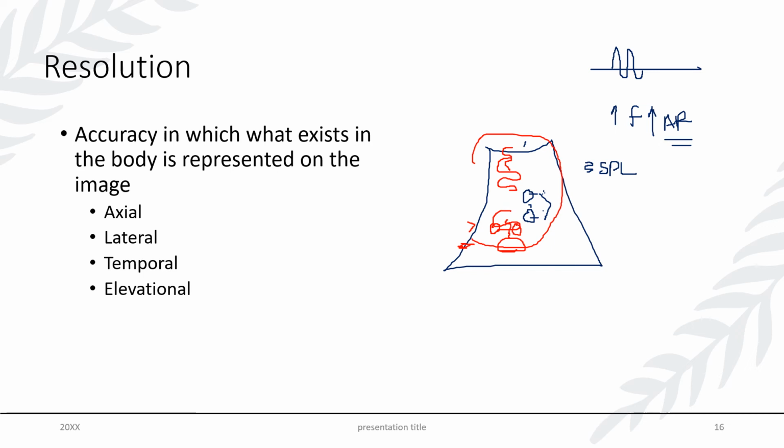A phenomenon of ultrasound pulses is that as they travel, they become more and more broad after a certain narrowing point. That narrowing point is what we call our focal area. We are allowed some adjustment of the focal area, which we'll cover more in transducers next week, but we do have to control our focus to keep our beam narrower, and those narrower beams are able to slide in between two different objects, bringing back information and improving our lateral resolution.